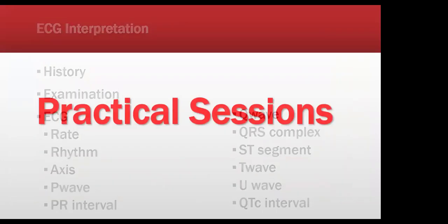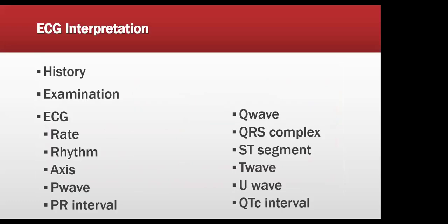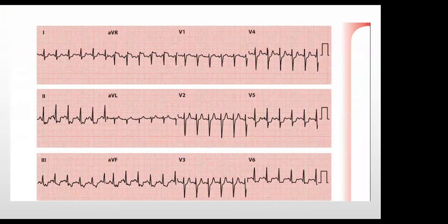Yeah, we know this. Tell me. Okay. So the AVR and left main, estimate AVR and left main. I don't know. I was thinking that the AVR is at the right side. So AVR is at what? The AVR and left main disease, the relationship. Just mentioned. The relationship.